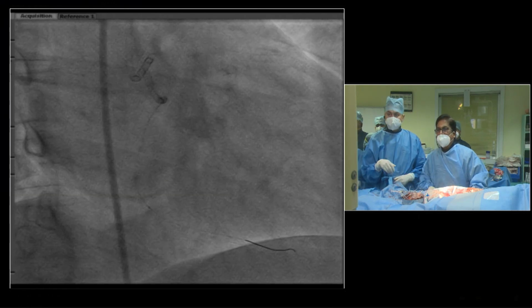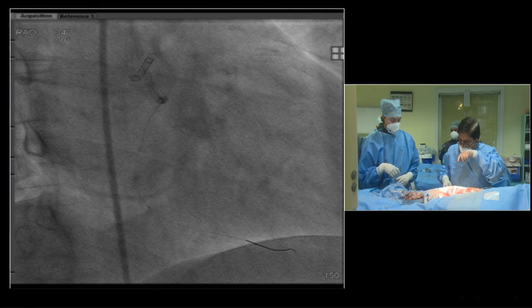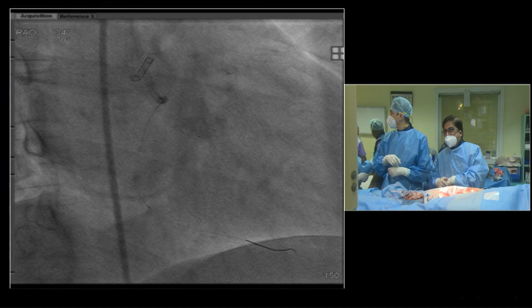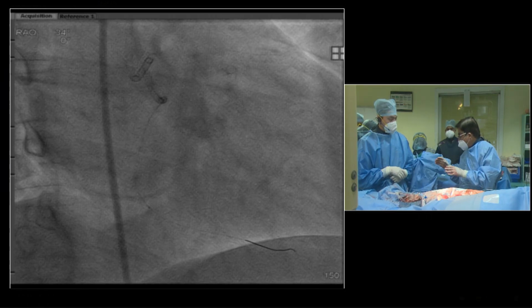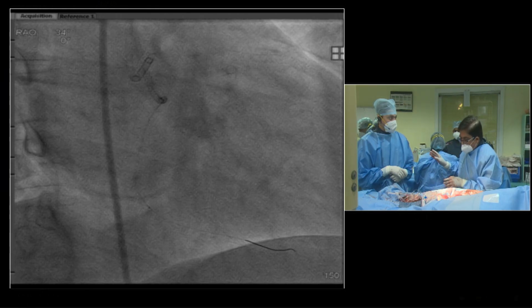Now do you use a balloon trap? Yes, I'll now use a balloon trap to remove the microcatheter. Balloon trap, please. Actually, Pratap, I am an antegrade man. I have realized. I always do antegrade. I find out the antegrade way, and if I fail antegrade, I will do Stingray and succeed in antegrade. You understand? I know that.